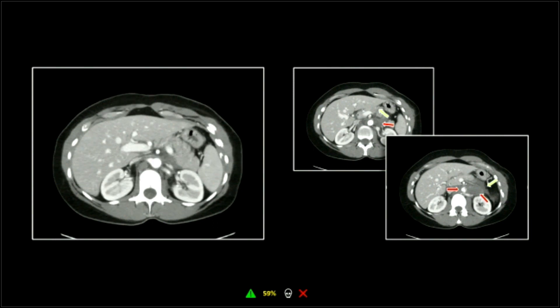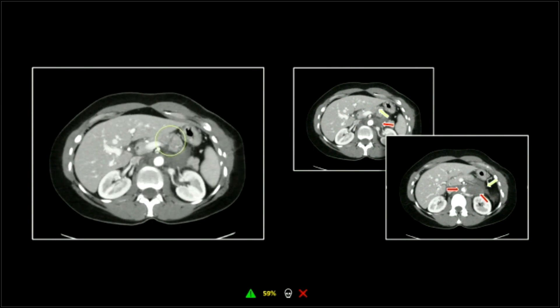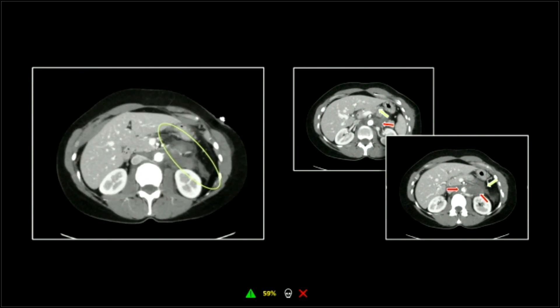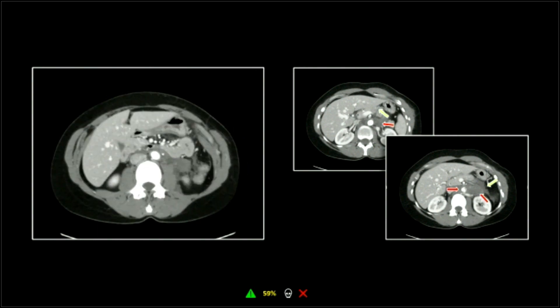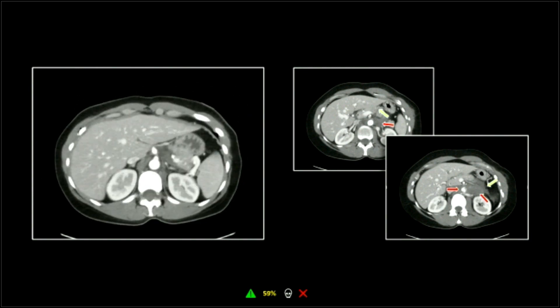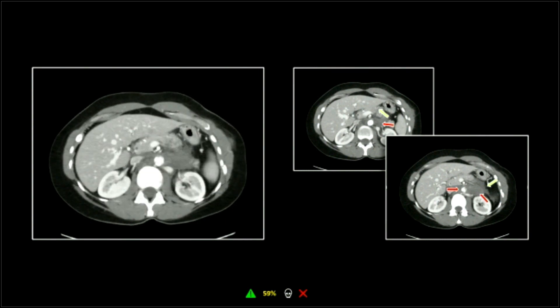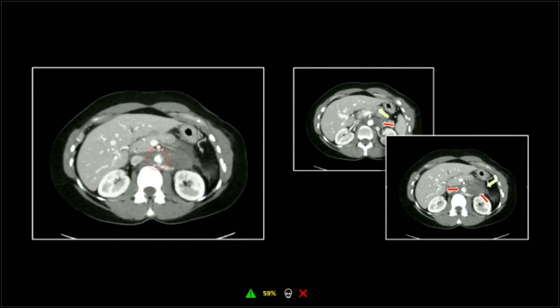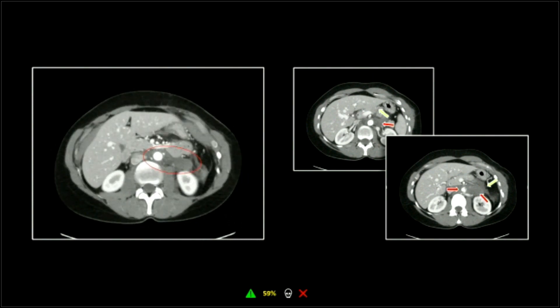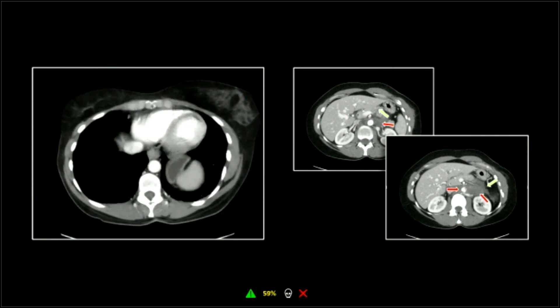Here's the cine on that. There's the pancreatic laceration, there's the peripancreatic fluid. But then when we go back through it, you'll see the hyperdense periaortic fluid that's actually in the perinephric space. Great anatomy lesson there.